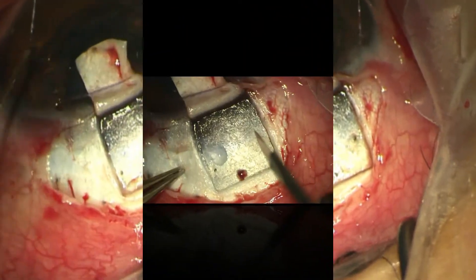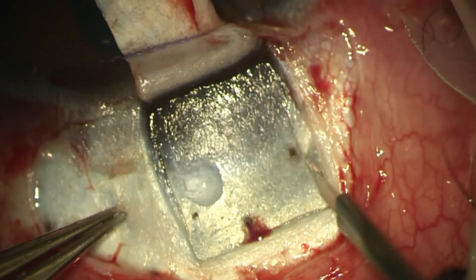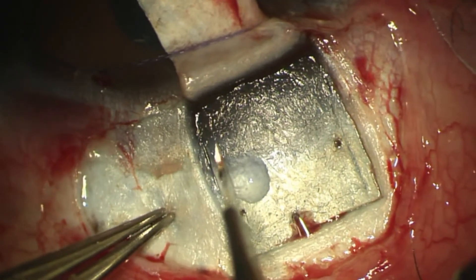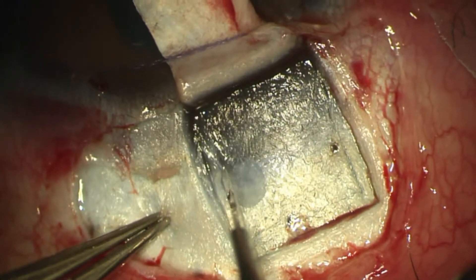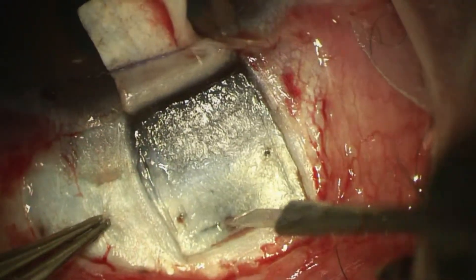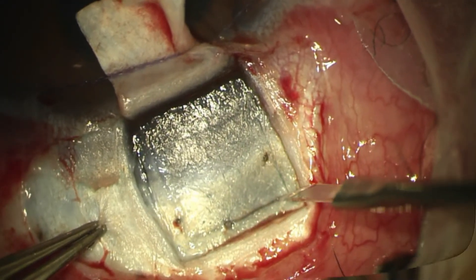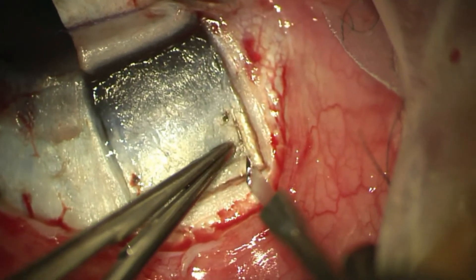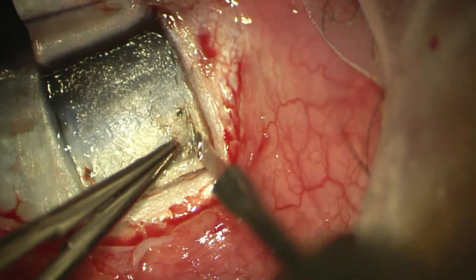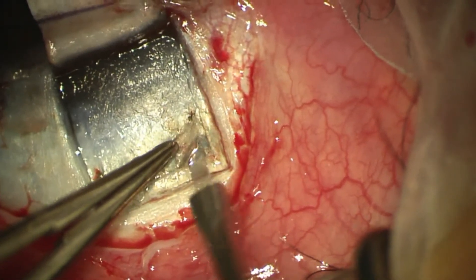We hold the superficial flap with traction sutures and keep it out of the way. We then increase the magnification of the microscope to see the details of deep flap dissection. The deep flap is usually dissected about half to one millimeter away from the superficial flap borders, starting from one of the corners, deep enough to the choroidal level.